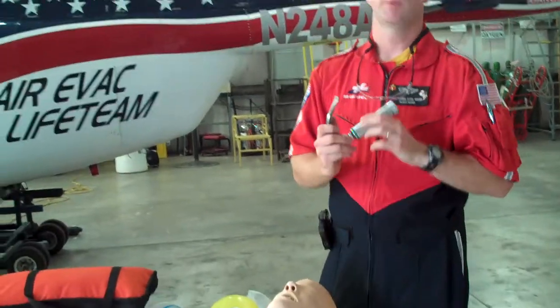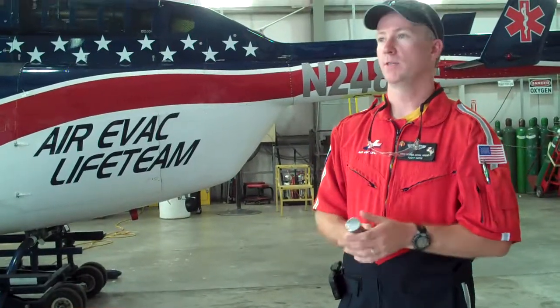So we went through the evolution. We saw how to bag valve mask a patient, and it's not considered to be invasive. We progressed on to an endotracheal tube intubation, and whenever we put metal in people's mouths, it's very traumatic. We as practitioners in the field try not to intubate people if we don't have to. We can use other non-invasive measures, but at times when the patient can't protect their own airway, when there's lots of secretions involved, or the patient's not oxygenating or ventilating well with a very low mentation, we will intubate them.